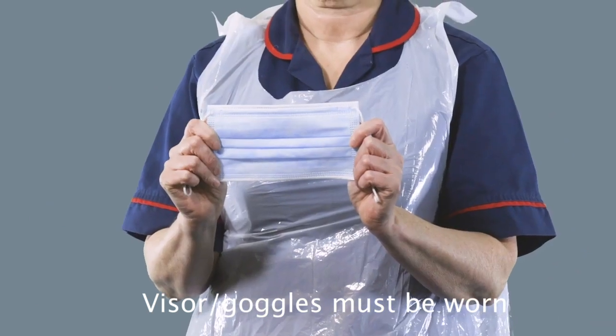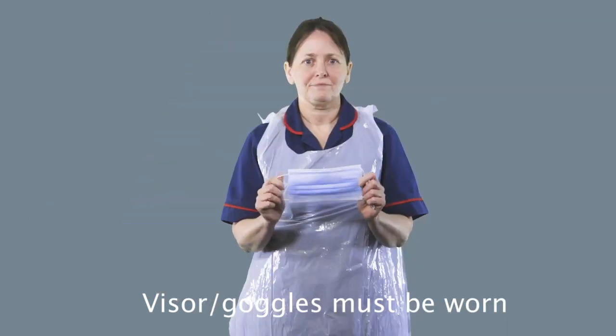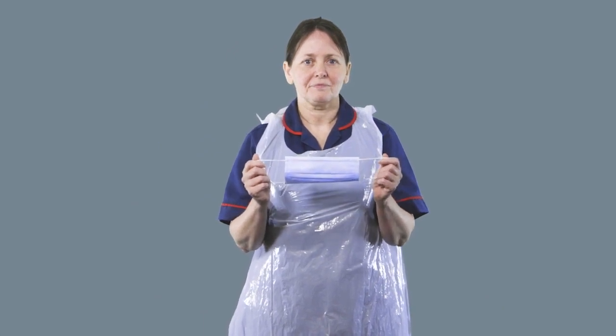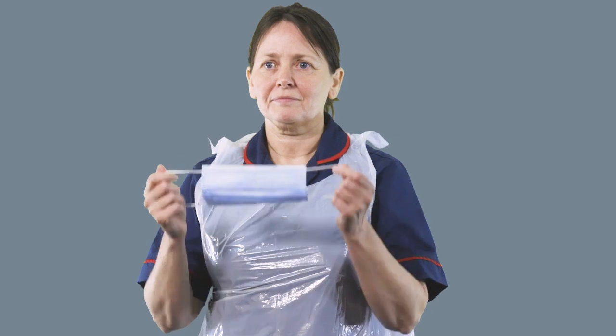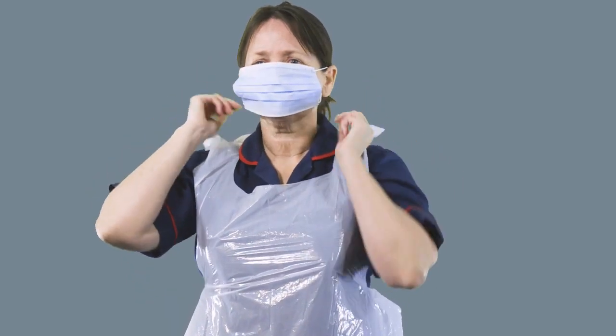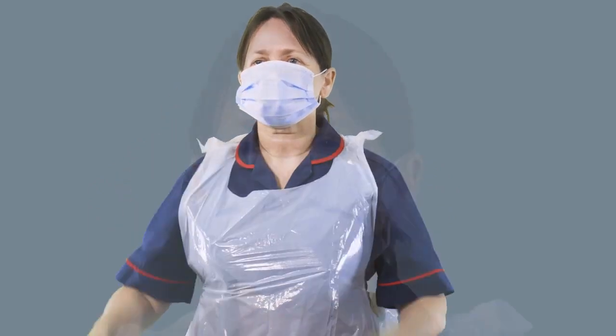Your next step is to put on your face mask. This is an ordinary surgical mask. Try not to touch the front of the mask, handling only the sides and the straps. Take the mask and put the straps behind each of your ears, ensuring it covers your nose, your mouth and your chin.